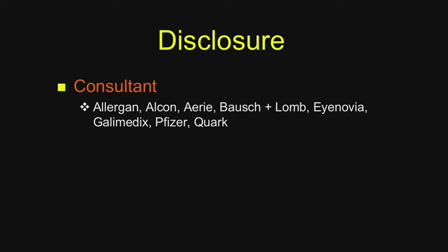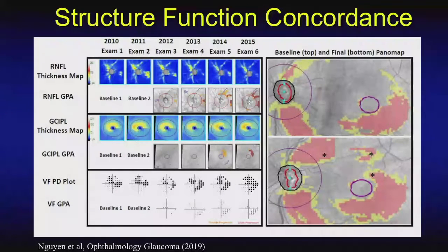And in fact, the toughest part of my entire presentation was to find an example of something that agreed quite well. And this is what I'm going to start off by showing you. This is an eye with very good structure-function concordance.